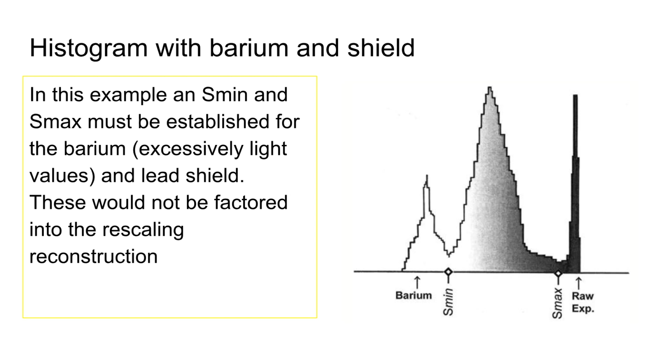Yes? I was going to say my clinical instructor actually spoke about it. She's like, senior year, she wants evidence of shielding. Yeah, and I think you should still do that for now. But hopefully the systems are smart enough, especially on a chest x-ray, because that's a classic example of where this type of rescaling error can occur. Hopefully they have built some logic into the algorithms to say there might be this wavy, curvy white lucency at the bottom of the image. Watch out for that. It's probably an apron, ignore it. So it's beyond my level to turn that into math, but that's what happens.